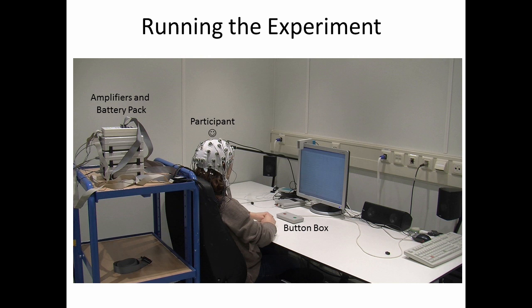Here you can see the participant sitting in the experiment room just before the experiment. We plug the electrode cap into some amplifiers that are battery powered, and the reason why we do that is because the signal, as noted before, is very very small. Also shown here is the button box the person will be using. In this case, they simply have to hit a left or a right button, and you'll see the task they're going to perform in just a second.